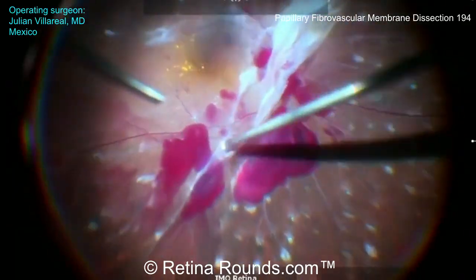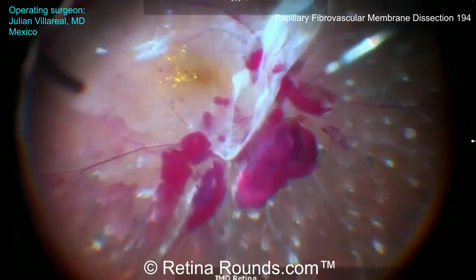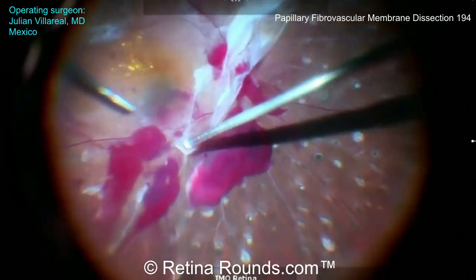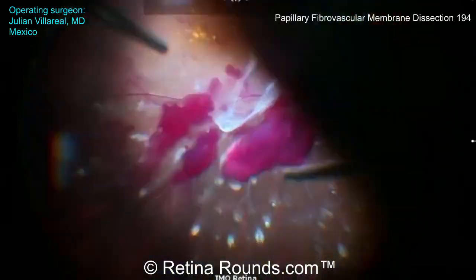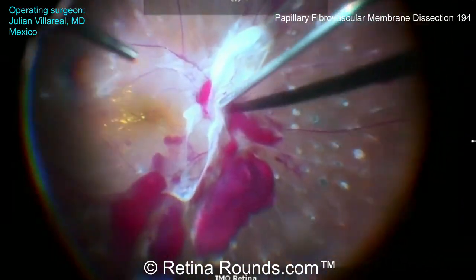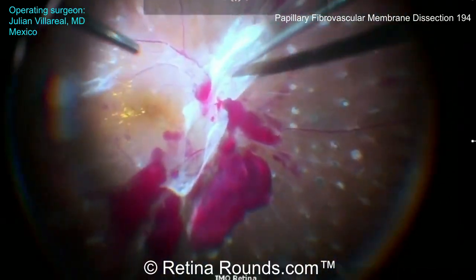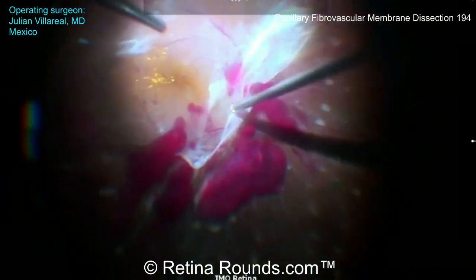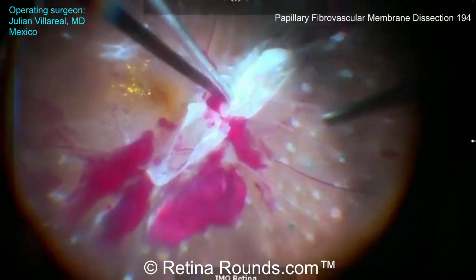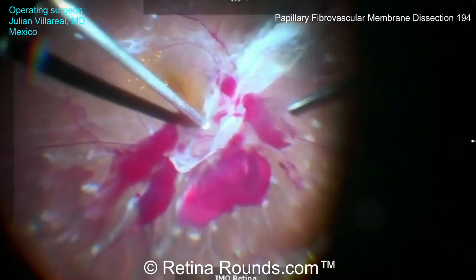The key in diabetic vitrectomy, as we've discussed in prior episodes, is to confirm that you're working within the proper surgical plane — that's between the posterior hyaloid face and the underlying retina. Accessing this plane can be achieved through an outside-in approach, which was the approach that Dr. Villareal initially used. But if vitreoretinal adhesions are tight over the macula, this plane can also be accessed from membranes over and around the optic nerve via an inside-out approach.